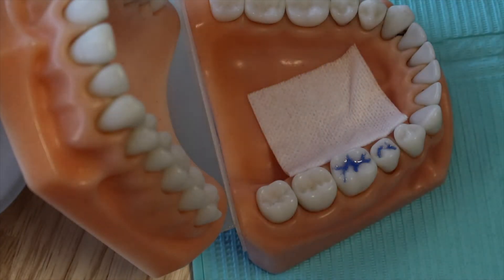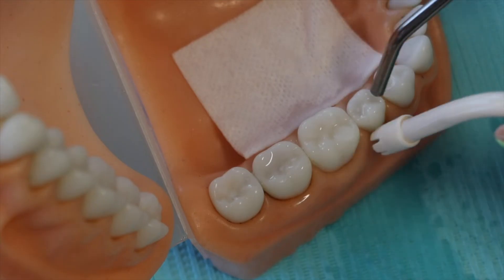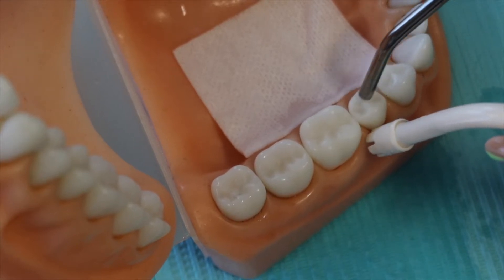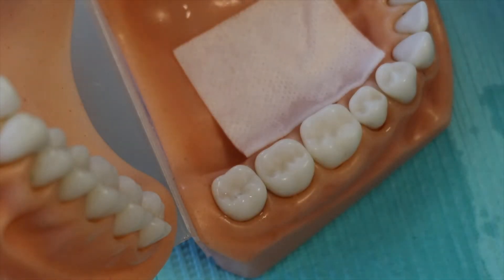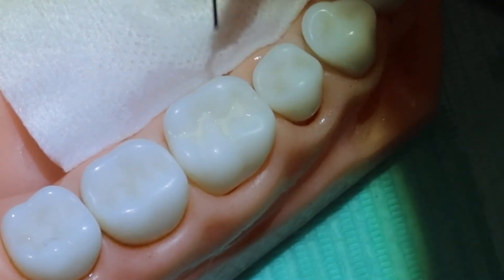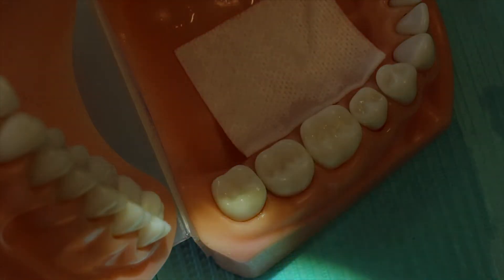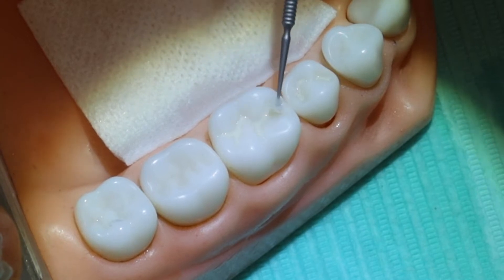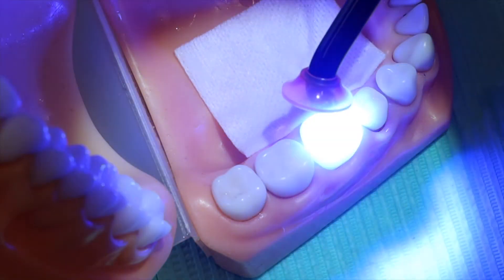Then we go ahead and etch the area. Let that sit for 20 to 30 seconds — you don't want any blue left. Then you dry it off. Once you dry it in a real mouth it will have a really chalky white appearance to let you know it is ready for the sealant material. Now that the tooth is nice and dry, we're going to go in with the sealant material, and just in case we got any excess, I'll take this micro brush to soak up some of it in areas where I flowed too much.